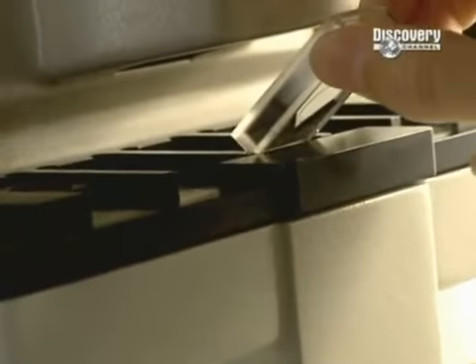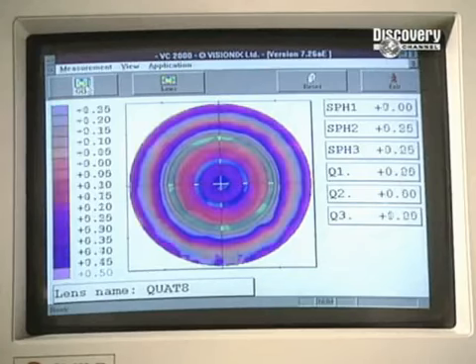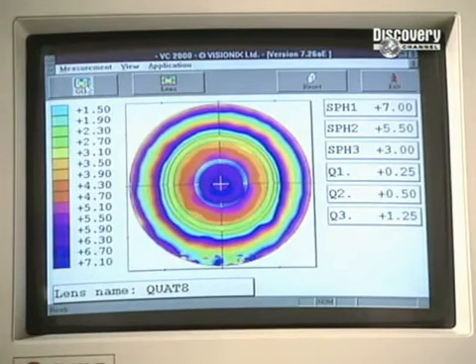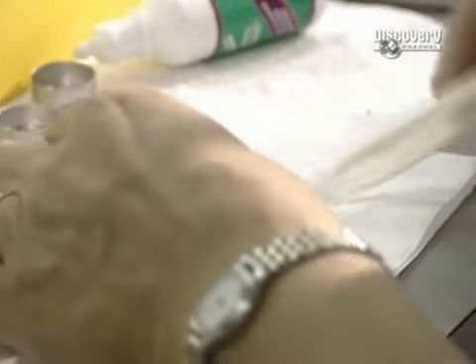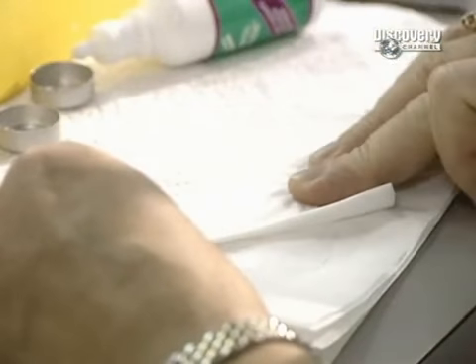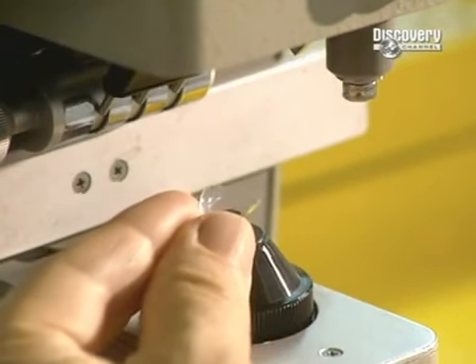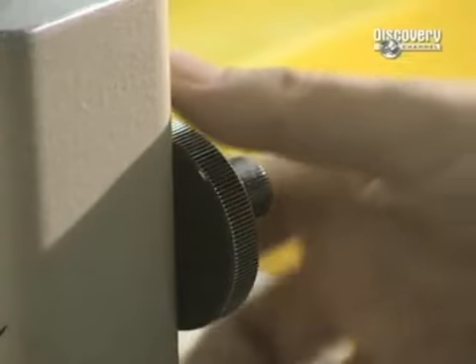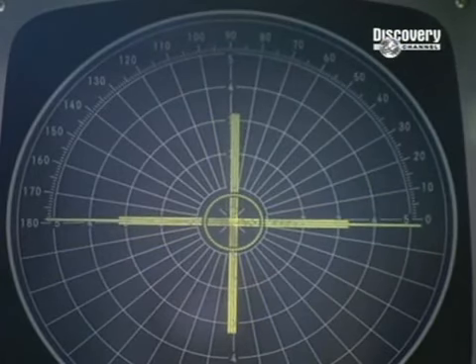Next, the lens is checked. An optical topographer is used to verify whether the spread of the optical power in the lens is precise enough. At every step, the soft, fragile lenses must be handled with the greatest of care. This unit, called a frontofocometer, is a metering device which verifies the optical precision of the lens.